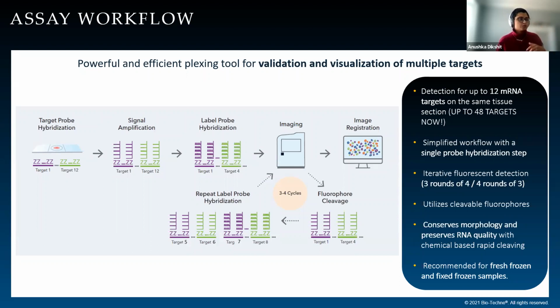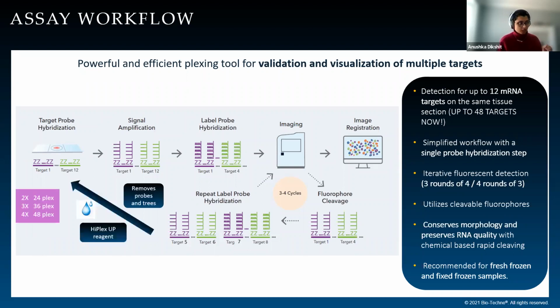So originally this was developed to detect 12 targets, but like I said, since then we have expanded the capability to allow detection of up to 48 targets.